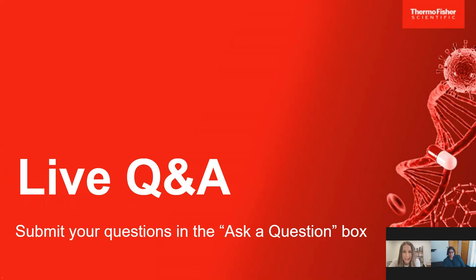Thank you. What is your take on universal antigen retrieval buffers? Do they work better than citrate or other specific pH retrieval buffers? Yeah, universal buffers also work very beautifully. I have personally used commercial buffers from different vendors, and they work similarly to a citrate buffer you make in the lab or purchase. They basically work fine, and with more efficiency compared to in-house made reagents, because there can be differences in composition, in the water you use, the pH, and those types of things. If you use the commercial one, the pH is guaranteed and the best quality reagents are used. So I have used it before and it works well.